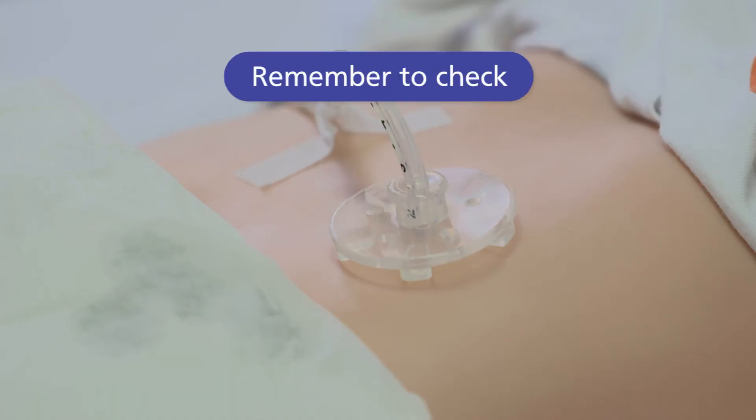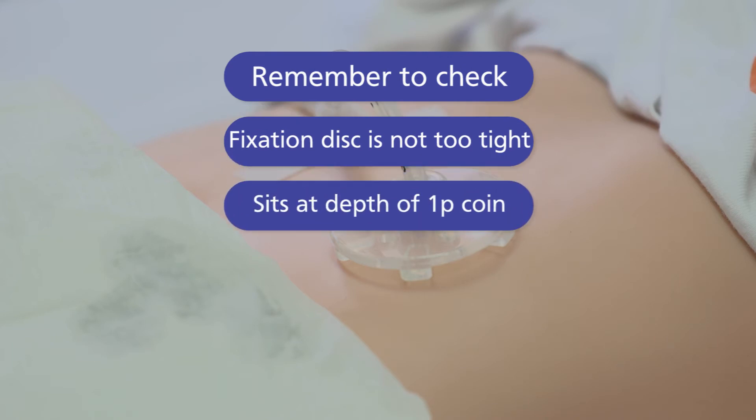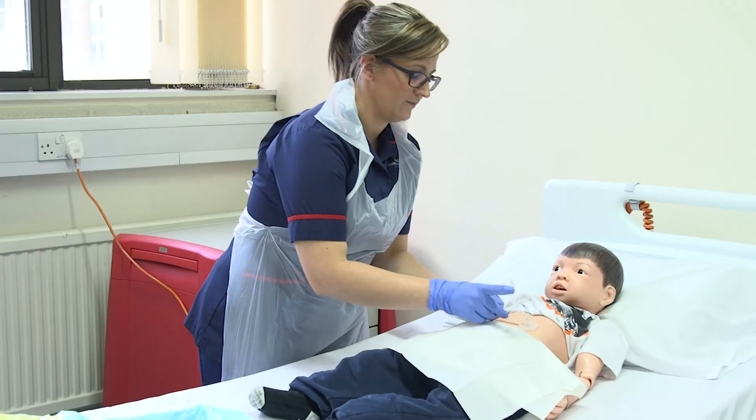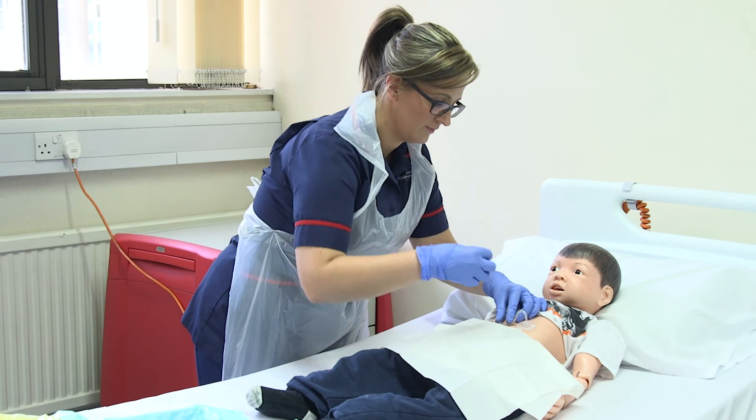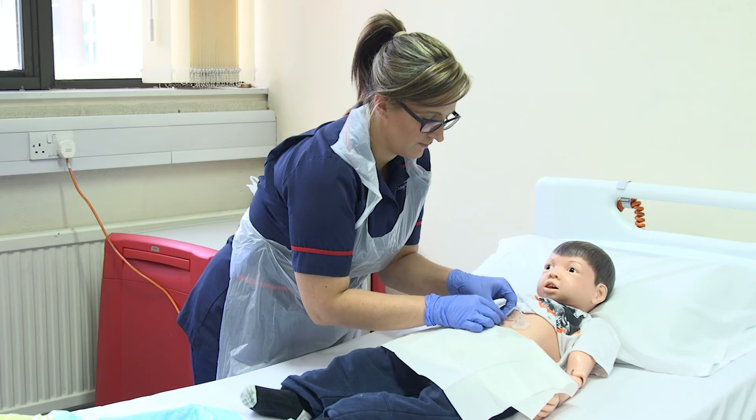It is important to check that the fixation disc is not too tight. It should sit at the depth of a one pence coin to prevent the disc from rubbing. After you have cleaned your child's site you need to secure the tube to the abdomen wall to stop the tube from moving and pulling.